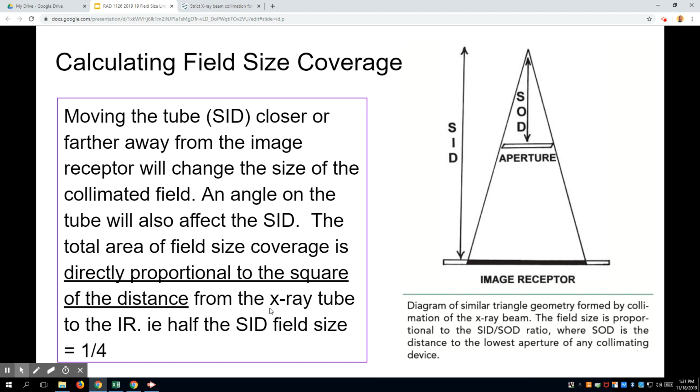But if you remove that patient, move them to the side, then it opens up and it's where you expect it to be, and your collimation looks correct. So what do you think technologists do? It looks small, so they open it up a little. They forget all the concepts about it diverging and going where it's supposed to go.